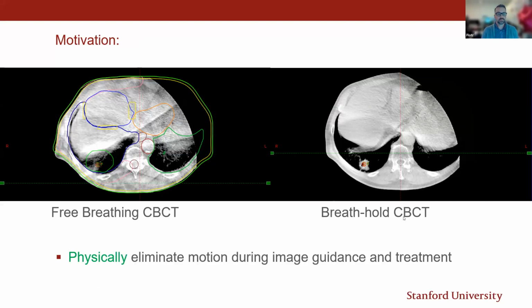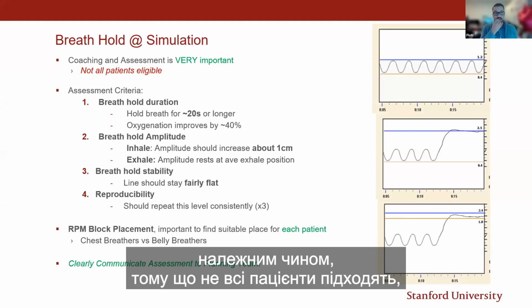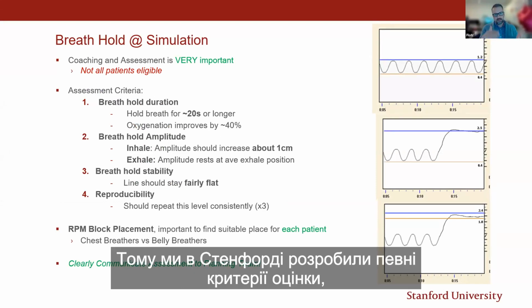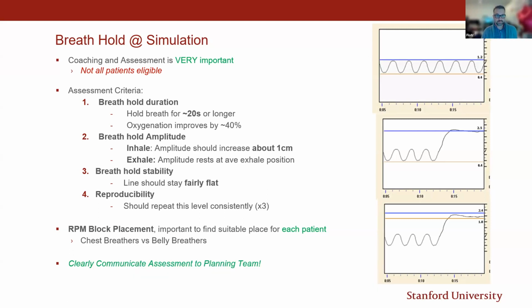So at simulation, it's very important that coaching and assessment are done properly because not all patients are eligible. Breath hold treatments are great because they have so many advantages, but not all patients can do them. So we at Stanford have developed an assessment criteria that is done at the simulation before the patient is scanned.